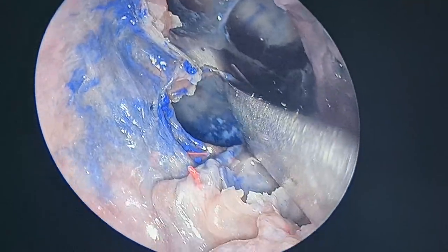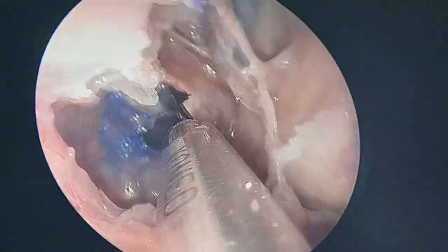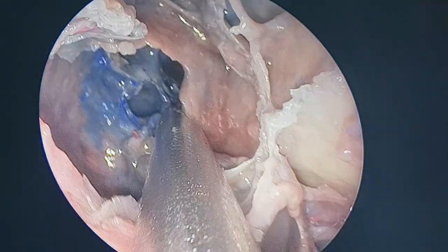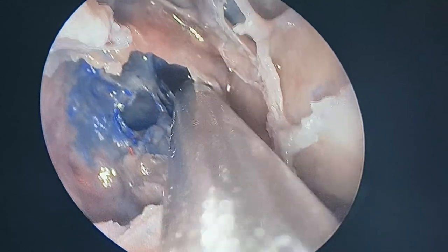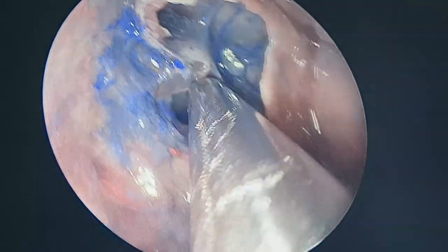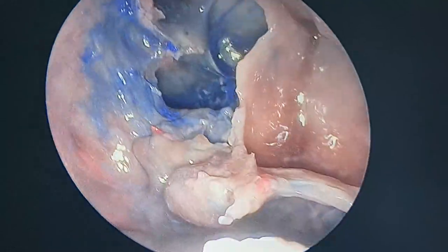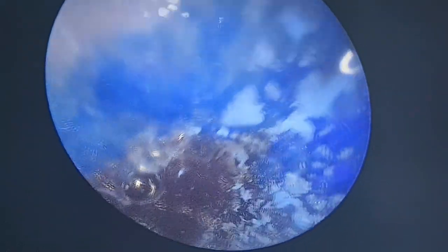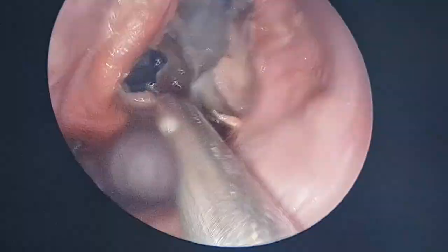Enlarge the sphenoid wall medially to widen the sphenoid ostium, rather than coming from laterally. If you come from laterally, you can be disoriented and damage the optic nerve or the carotid artery. And these disasters we have seen reported in literature, unfortunately sometimes. This is our proposition to prevent this injury in any given sinus surgery, which we have been following at our centers, having done thousands of sinus surgery procedures. One can always protect the carotid artery and the optic nerve by this principle.